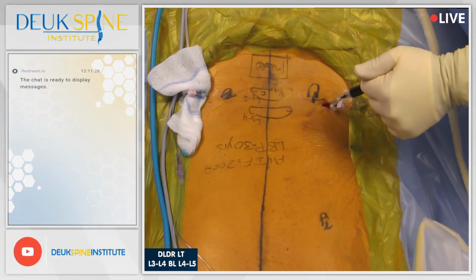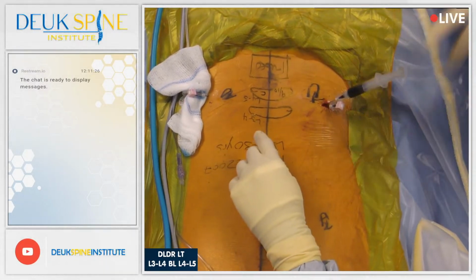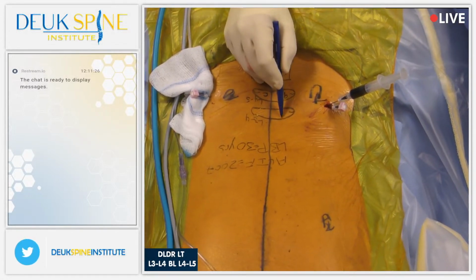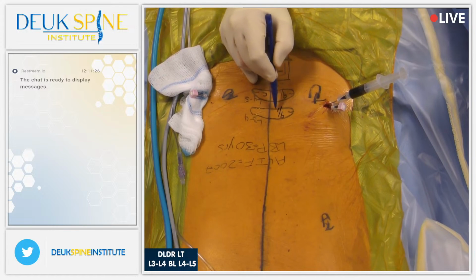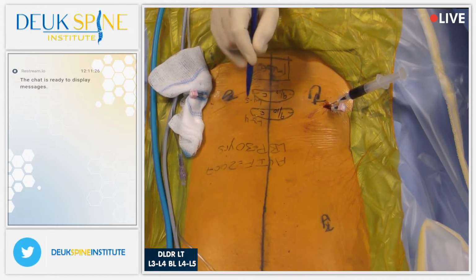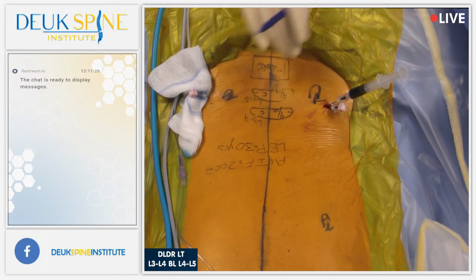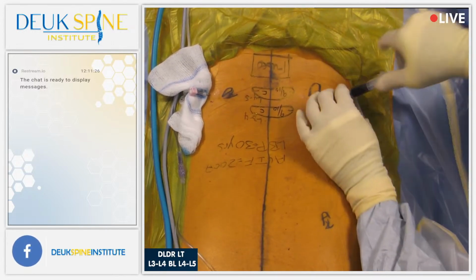How bad is that on a scale of 1 to 10? 9. Is that where you typically get back pain? All right, now we're going to put you to sleep. When you wake up, we'll be done with your surgery, okay? Thank you. And you'll have all your body parts fixed. Thank you. All right, count from 1 to 100 out loud for me.